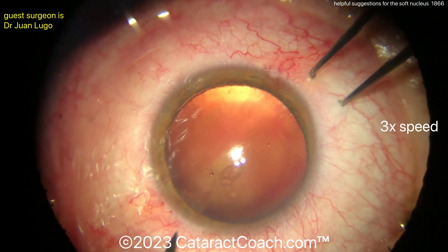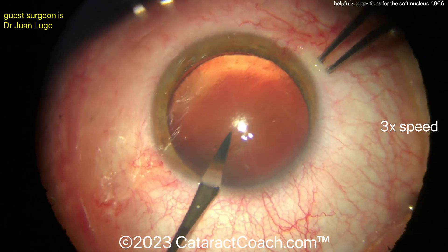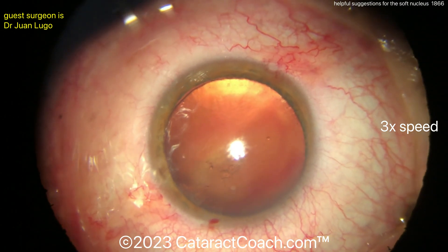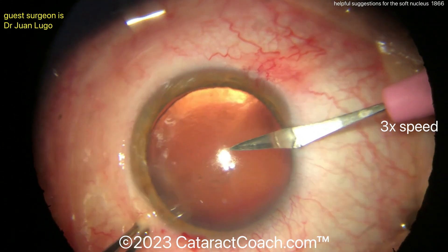We sped it up to three times normal speed here. Our surgeon is going to start off with making a paracentesis — there's one — and here's another paracentesis. So maybe you're going to be doing a bimanual cortex removal.